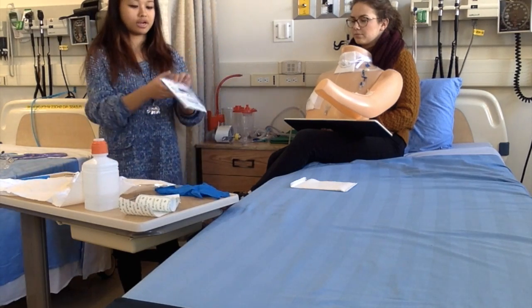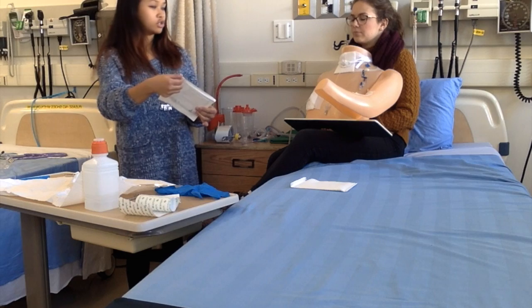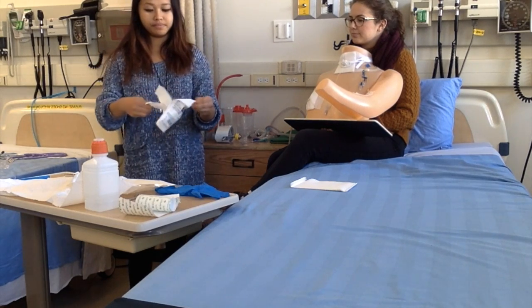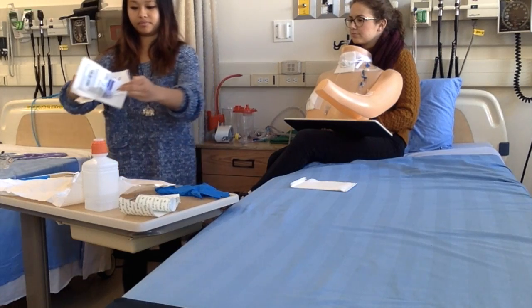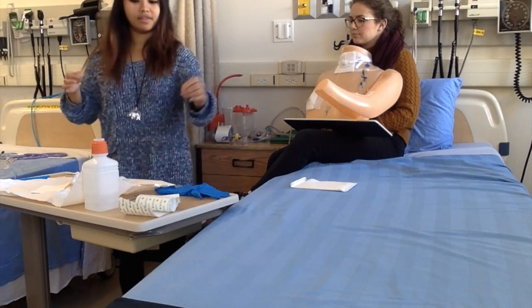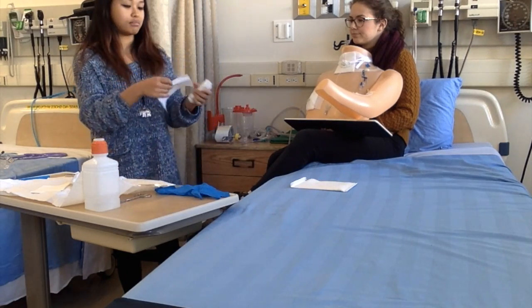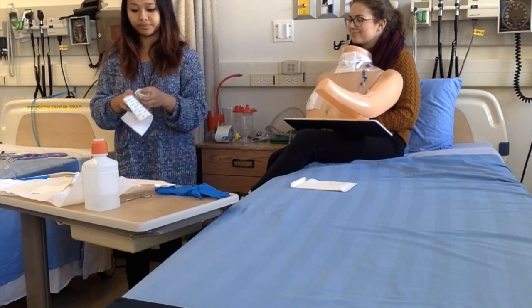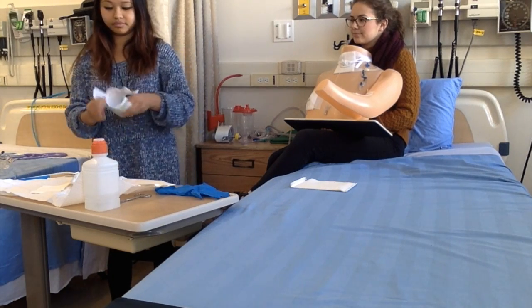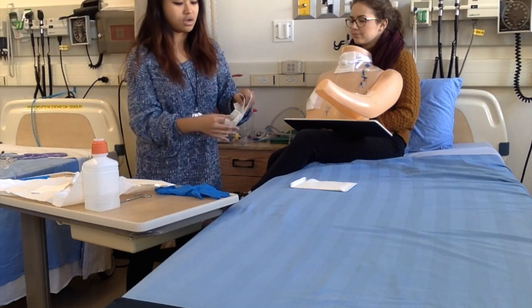Okay, so I'm just going to put just regular drainage sponge on top of the site. And then over that sponge, I'm going to put some Mefix, which is bandage. Put this to the side for now.